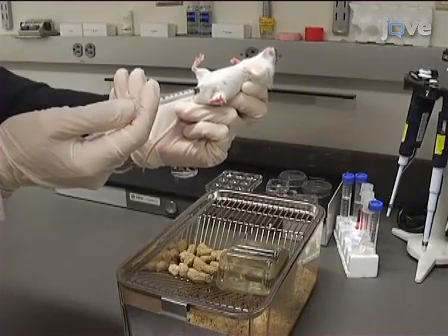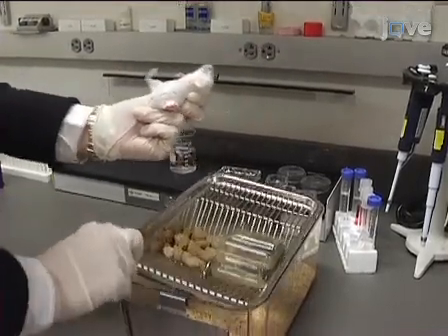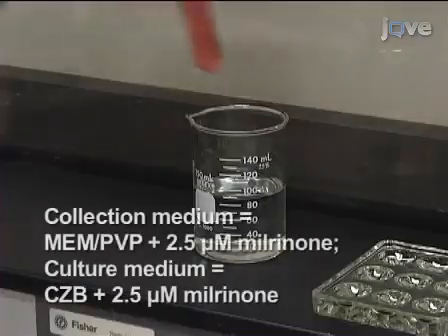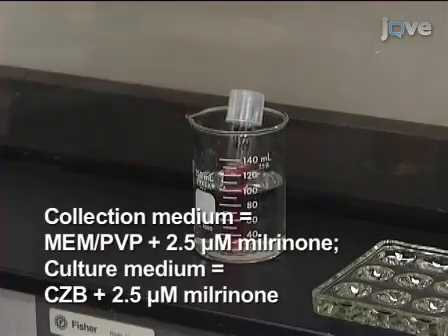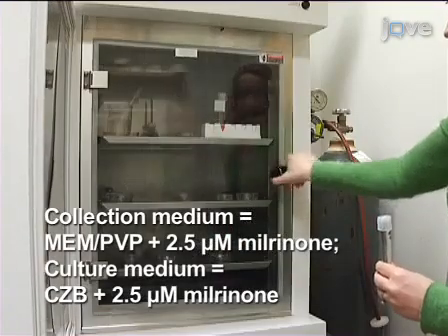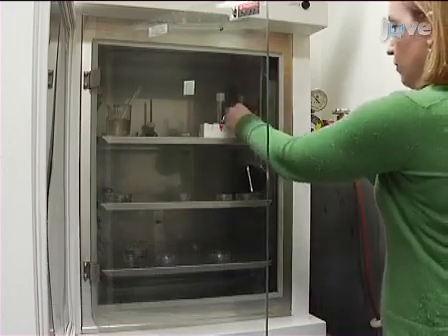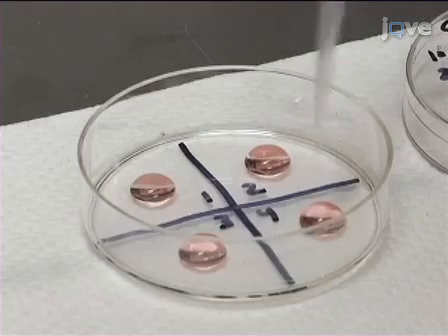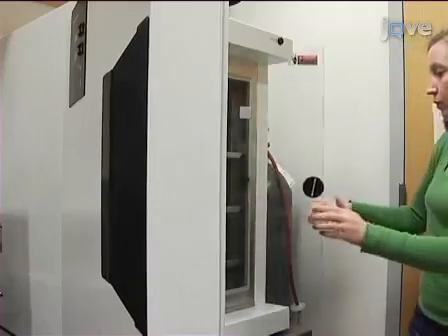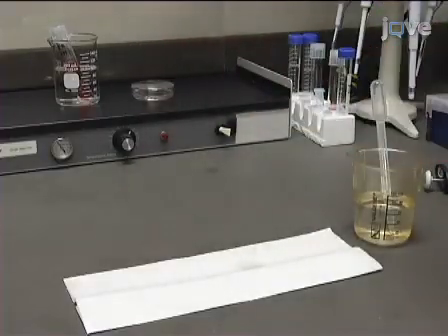Intraperitoneally inject sexually mature female mice with 5 IUs of pregnant mare's serum gonadotropin to maximize the number of antral follicles isolated from each mouse. Approximately 48 hours after PMSG priming, warm 3 ml per mouse of collection medium at 37 degrees Celsius and equilibrate 1 ml of culture medium for at least 1 hour. Set up microdrops of each in a petri dish and overlay with mineral oil. Now place the culture medium dish into the incubator and the collection medium dish on a slide warmer.